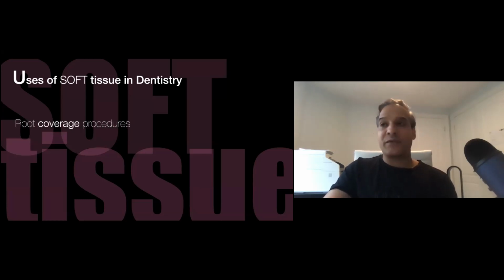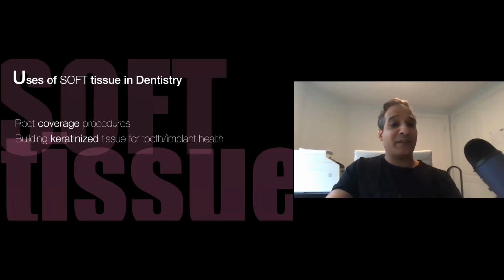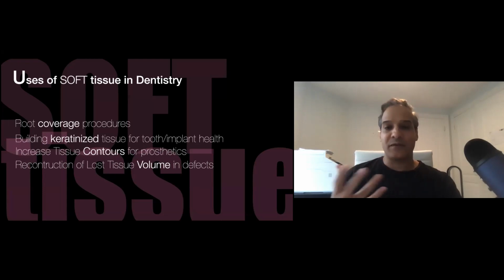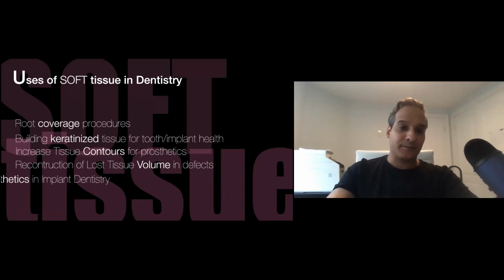Obviously the number one most common one is root coverage. We have building keratinized tissue, especially around teeth and implants. You have increasing tissue contours for prosthetics. That can be something as simple as a Pontic site to make it look more natural, or even building up tissue contours for an implant site. There's reconstruction of lost volume, whenever we have cases where there's some ridge atrophy, sometimes a combination of building up the ridge with both bone and soft tissue.